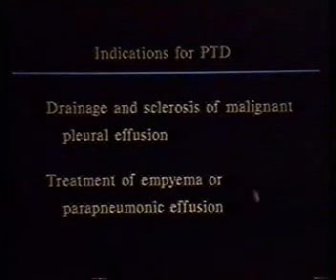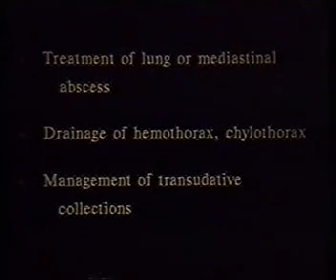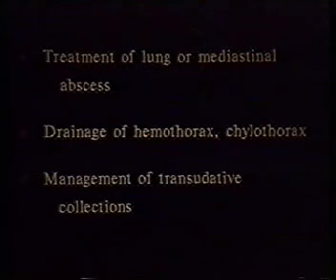We were also not uncommonly asked to drain infected parapneumonic or postoperative fluid collections, particularly at our county hospital. On occasion, we will be asked to drain an abscess in a patient who either is not considered for surgery or even in a preoperative setting in whom the surgery is risky because of the severity of the patient's illness.